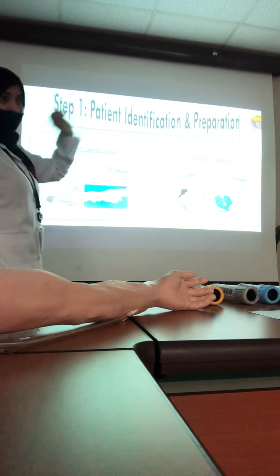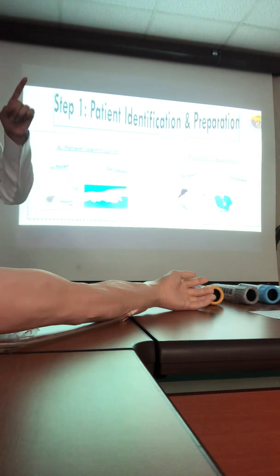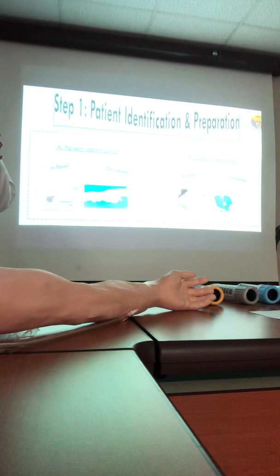In the outpatient department, we ask the patient to spell their name and give the medical record number, compare the response of the patient, and validate. Never ask the patient, are you Fatima or are you Muhammad? We should ask, what is your name?